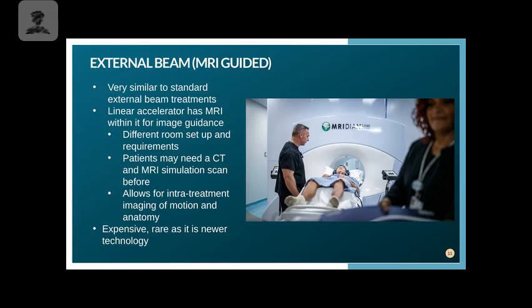So your safety protocols change because MRIs use a very strong magnet. So you can't bring certain things in there. The materials have to be different. There's a lot of safety protocols.